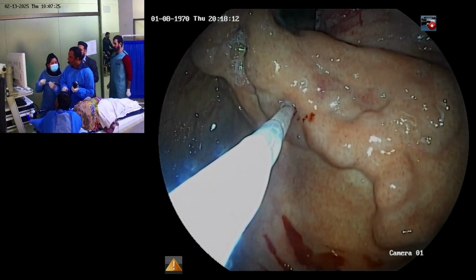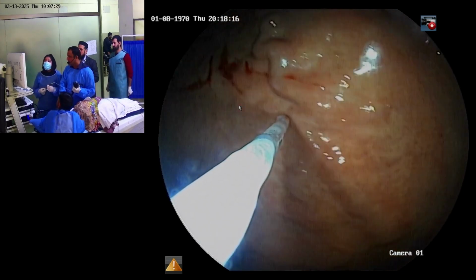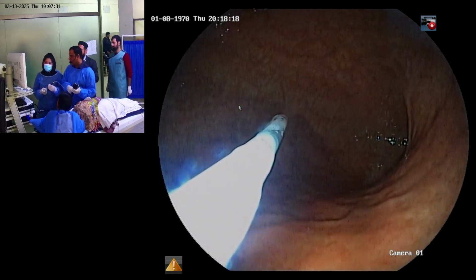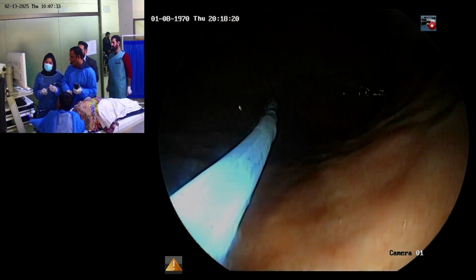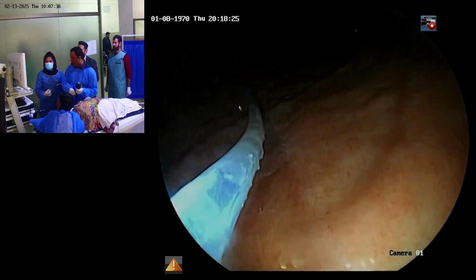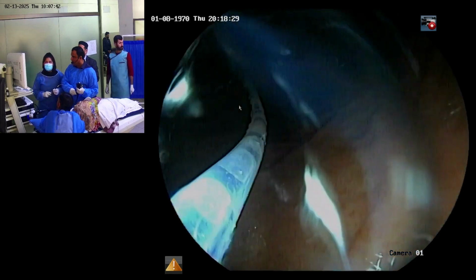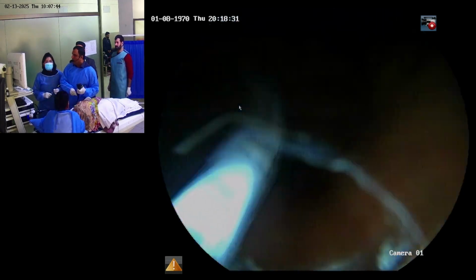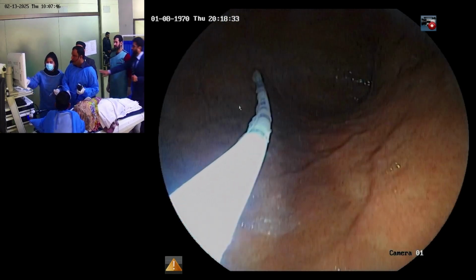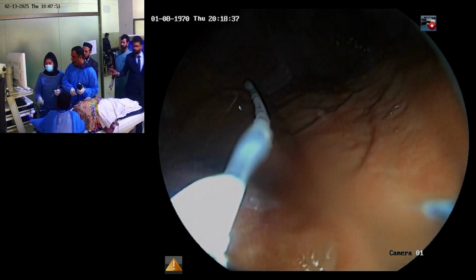Again, push in. Yes, look. You should not be doing suction, rather flushing.